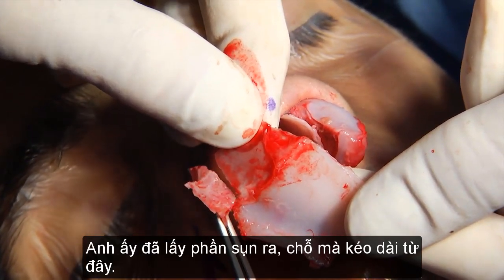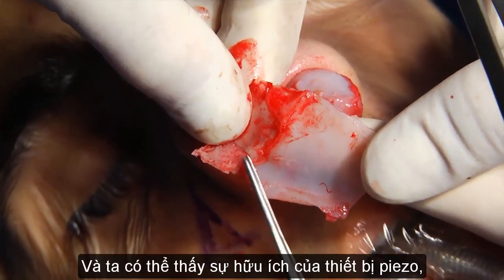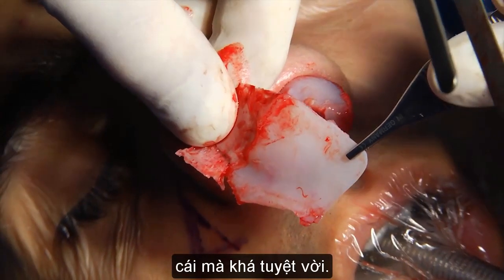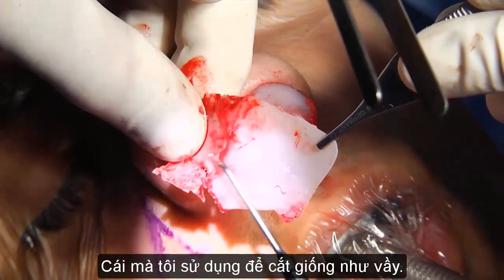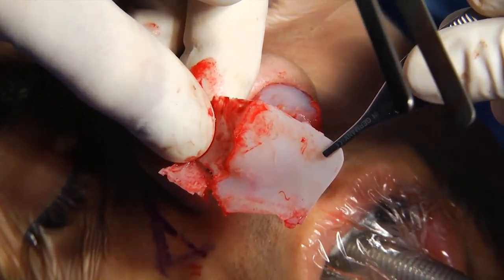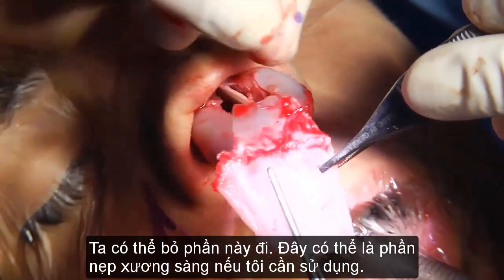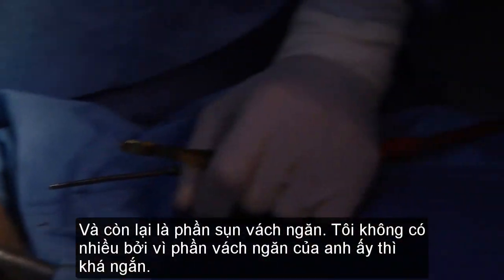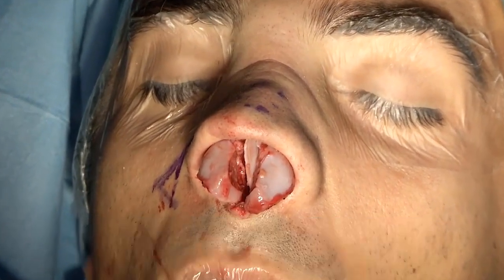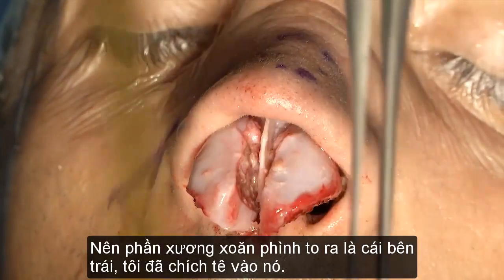He took the cartilage portion off, which extended from here, and see the use of the piezo device, which is really brilliant, which I used to cut like this. So now I have this. This can be dumped, the cartilage he took out. This can be an ethmoid splint if I need it, and this is some septum. I don't have much because his septum was short to begin with. So the big turbinate is the left one. I already infiltrated it.